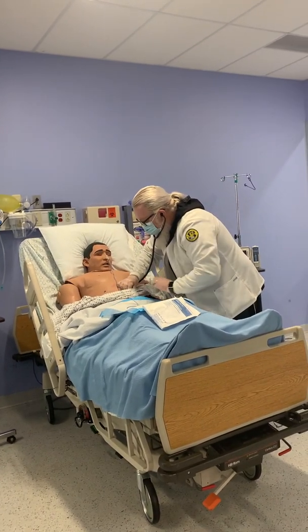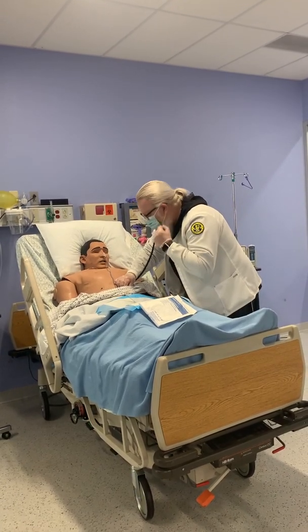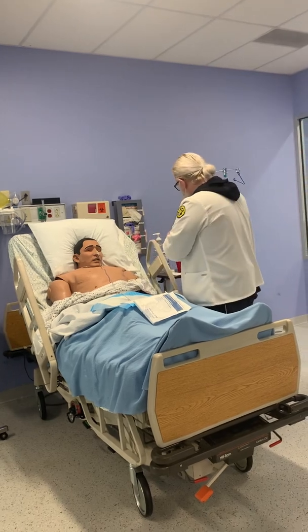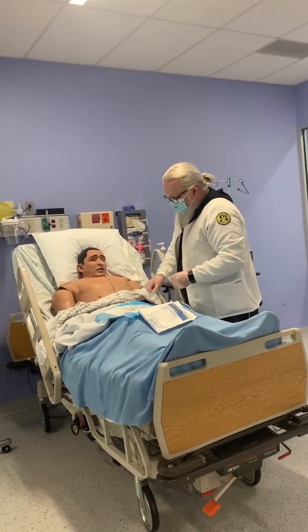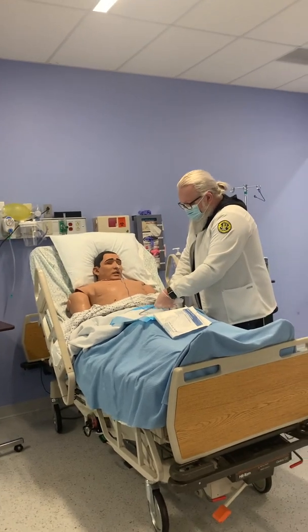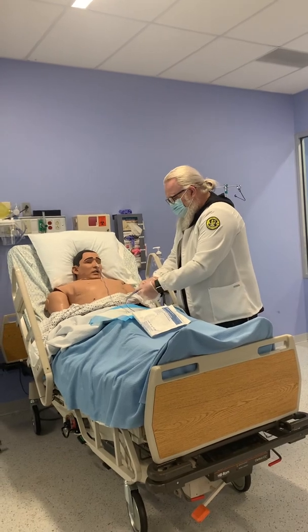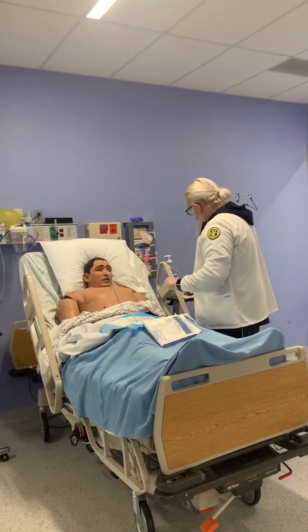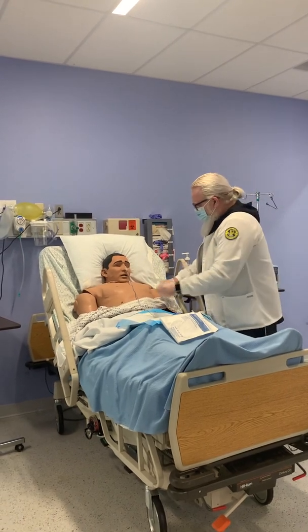Just above the umbilicus. And I do hear a whoosh of the air going in, so that's good. Shows me it's a good place. So that's 2 of the parameters. We've checked the pH, and we've also checked to hear the whoosh for auscultation. I'm gonna remove this. And before any medications, we would also see if the doctor would order an x-ray for us.